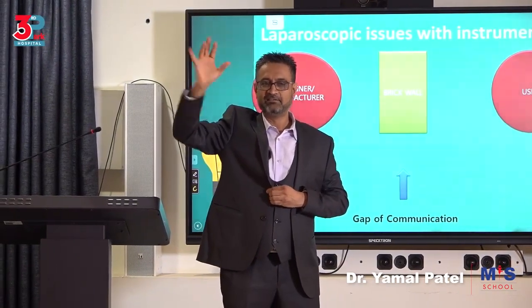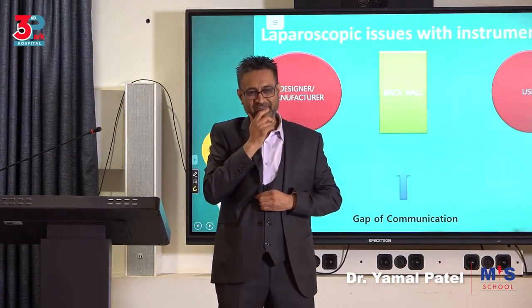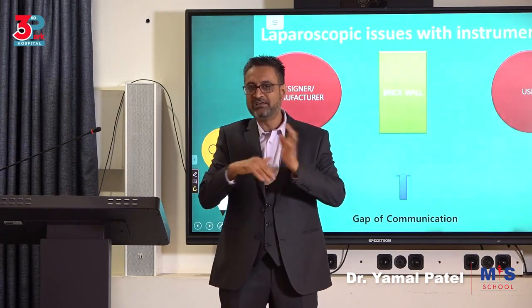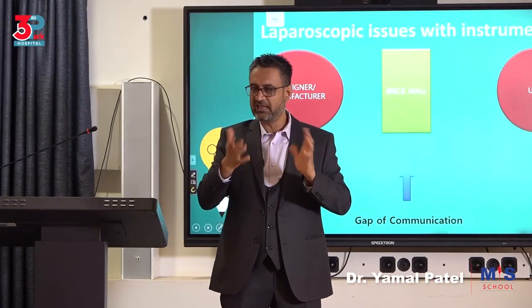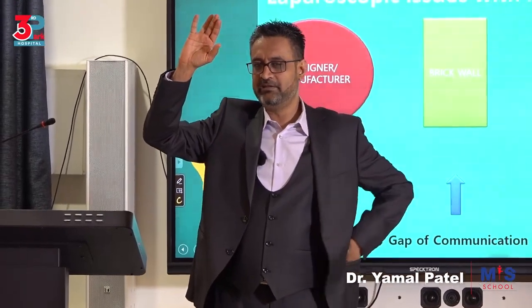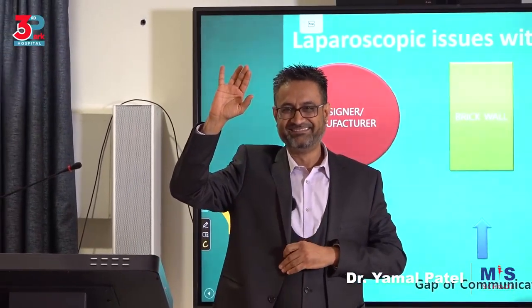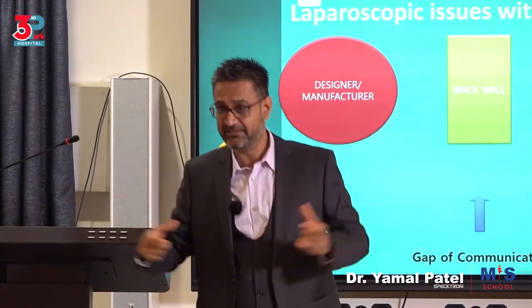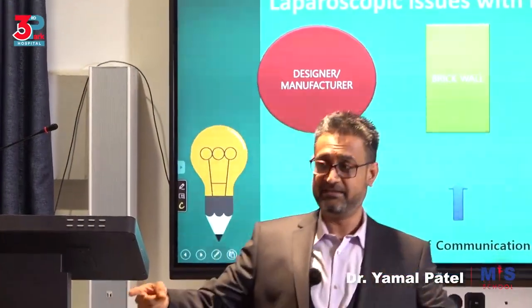6.5? So why are we using different size gloves? Because it fits better. Am I right? When you use the wrong size, does it not feel funny? How many of you have done laparoscopy with different sized instruments? Are they not all the same? They're standard, am I right? They're all 36 centimeters, and they all have the same handle.